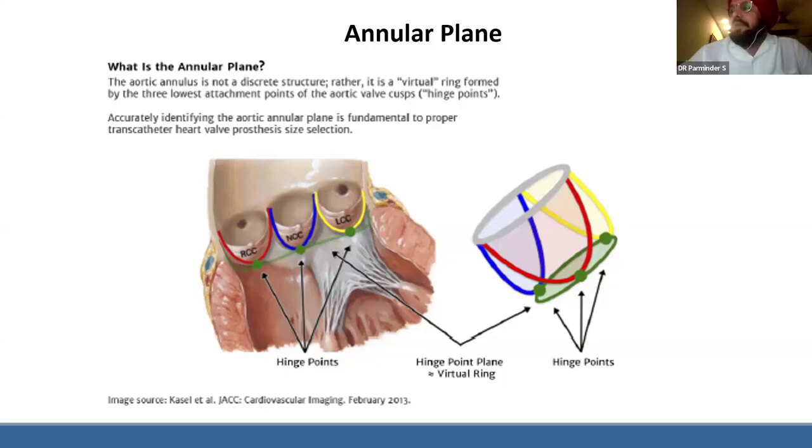No, we have become lazy actually. Now the system is so good, I'm telling you, that it will tell you these are the best images. And you just decide whether they're reliable or not, depending on whether the images available are systolic phase or diastolic phase.